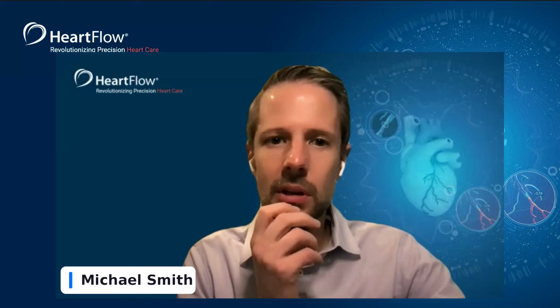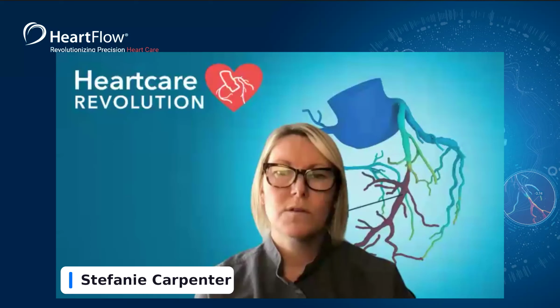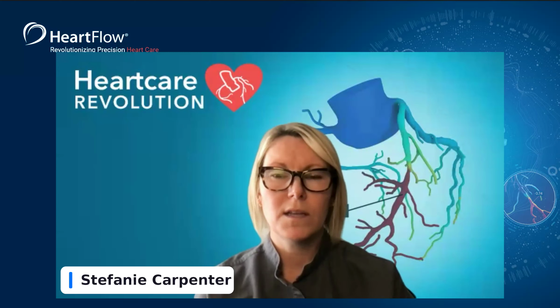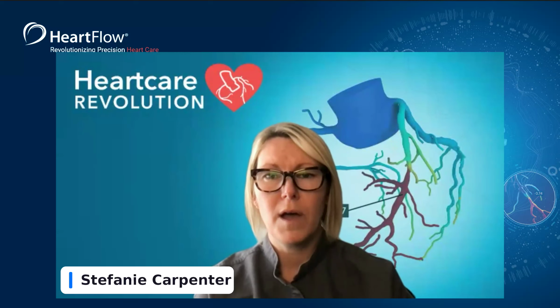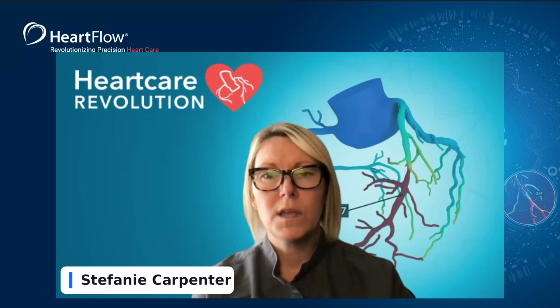And then to Stefanie here, how about this one? What do I do if I cannot get an 18 gauge angio in my patient? That's sort of the next option there. If you're unable to get an 18 gauge angio, the next option that you can try is to use a diffusix catheter if it's available at your health system. A 20 gauge diffusix catheter is going to be able to accept flow rates up to 10 mLs per second. So if you can't get the 18, the 20 is kind of the next best thing.